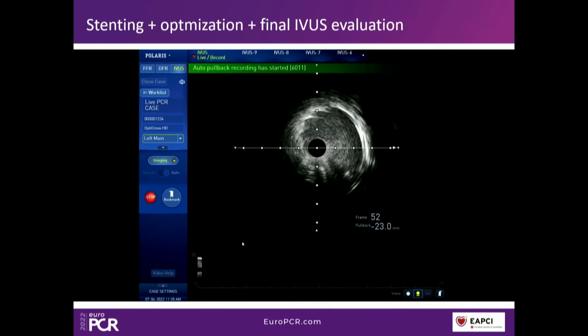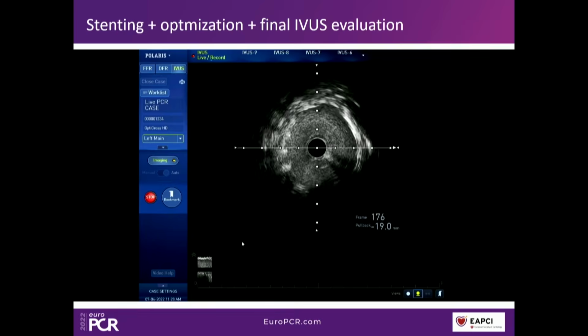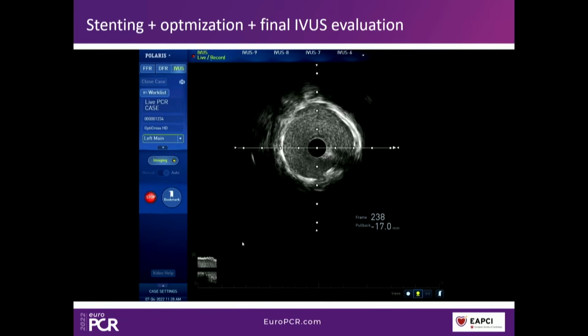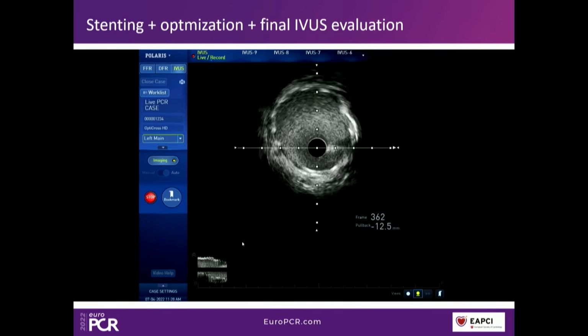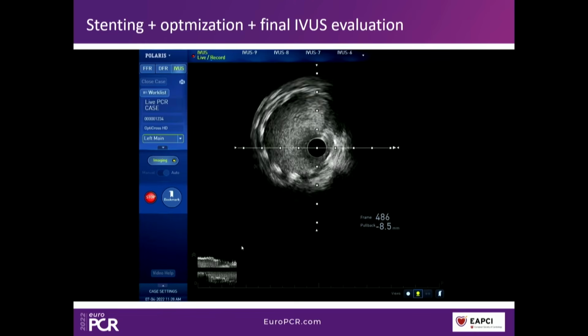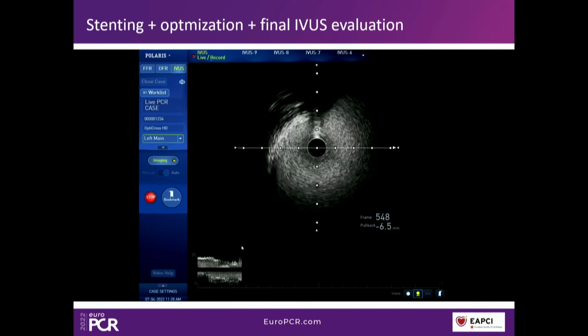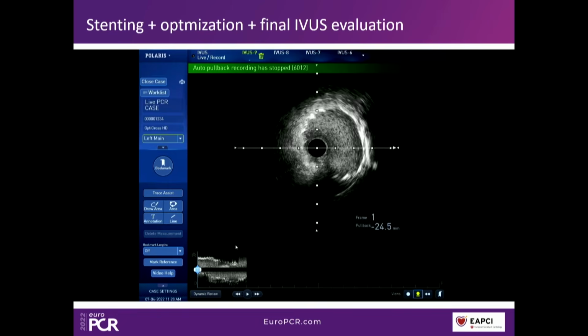I think that was our osteal LAD, was it? Yeah, I think that was the ostium. You see that there's the branch we've done, which looks okay. It looked okay on there, didn't it? So left main looks really well expanded the whole way. It was the distal bit that was most of it. Oh, there we go. That looks fine, doesn't it? Yeah, it was landing nicely.